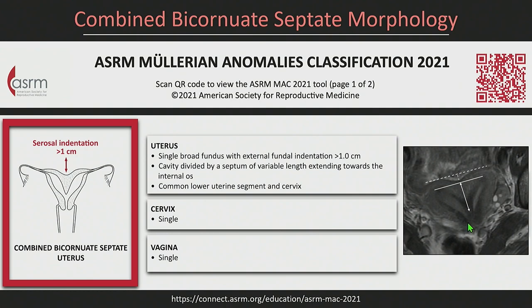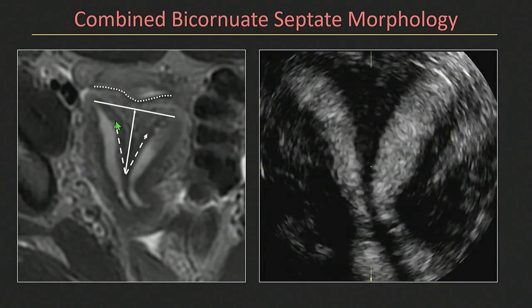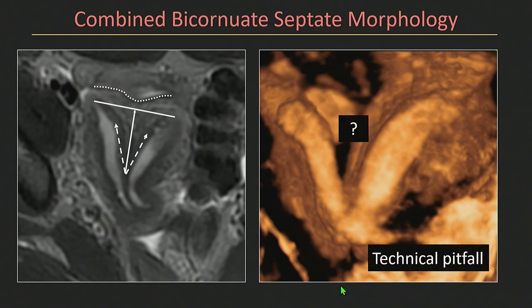Here's an example where it's hard to see the fundus perfectly, but maybe a little indentation. Here's the interstitial line, the depth, and the angle — this looks at least septate, maybe with a little indentation at the top. I wanted to bring up this case because if you change the gain on the 3Ds, you can actually eliminate the myometrium and just leave yourself with the endometrium, so it ends up looking more like a didelphys or bicornuate uterus, even though this would be closer to septate morphology. This is a technical pitfall.